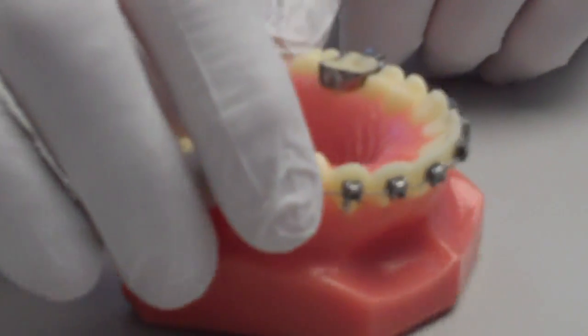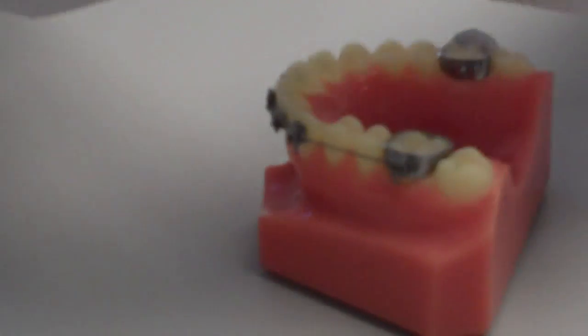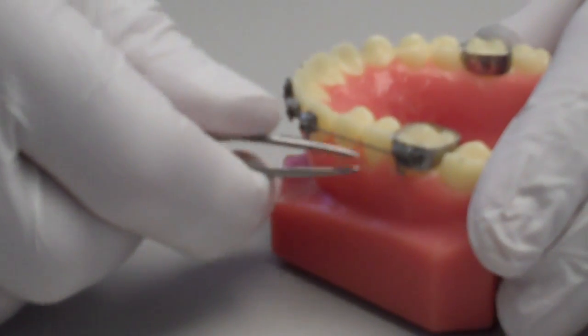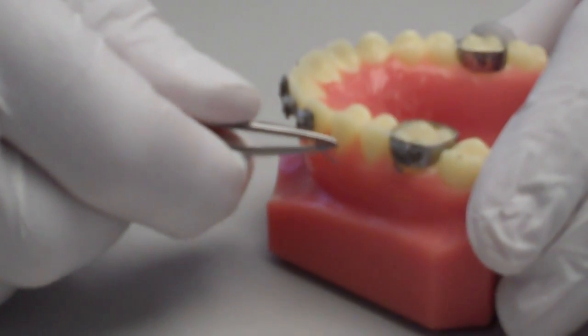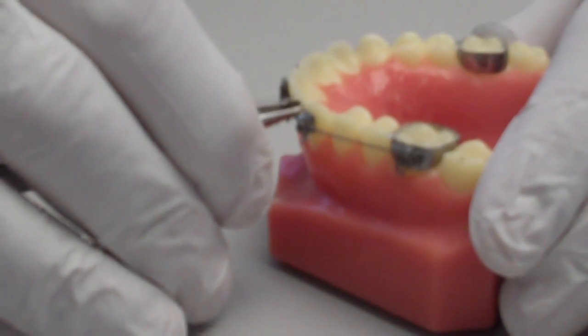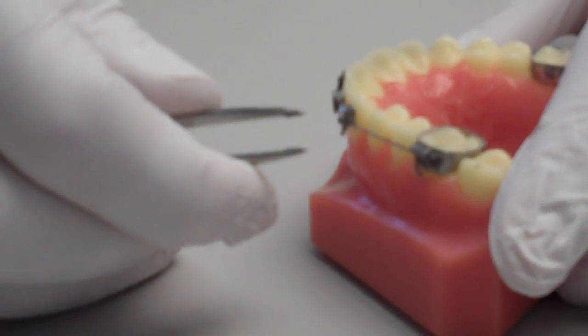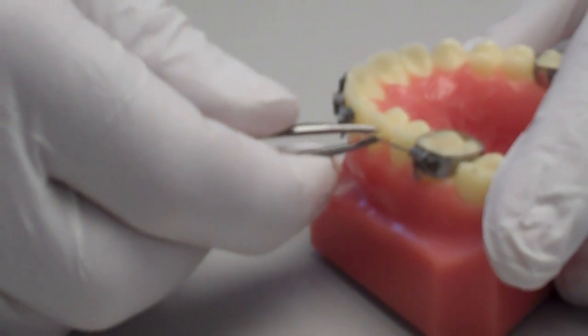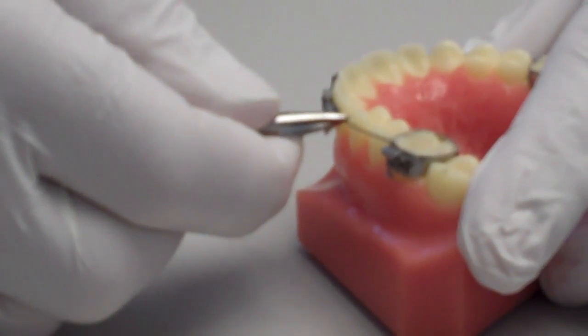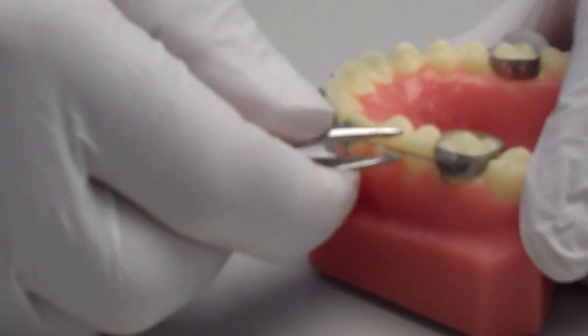If I turn my model around, let's talk about another common problem that we often see with the braces, and that's a wire which has actually come out of the last brace, as you can see here. This happens often when there's a big distance between the front braces and the back braces, as you see on this model. The first solution to this problem would be, again, using the tweezers to grab the wire, bend it a little bit, and replace the wire back into the brace, as I did there.